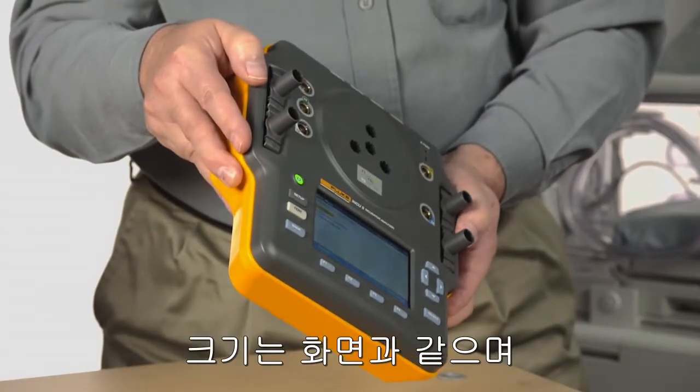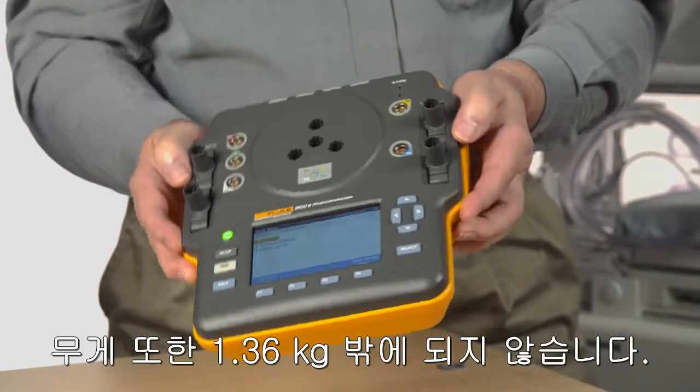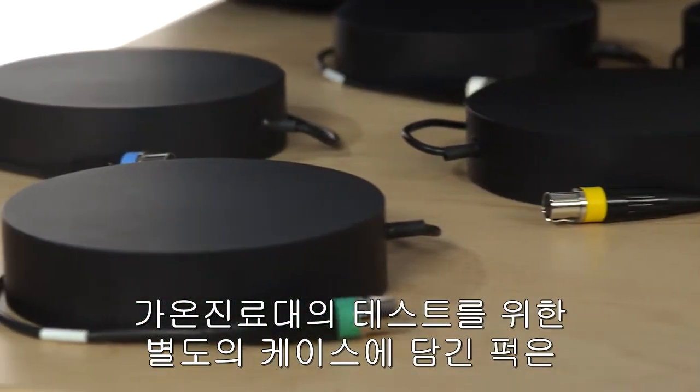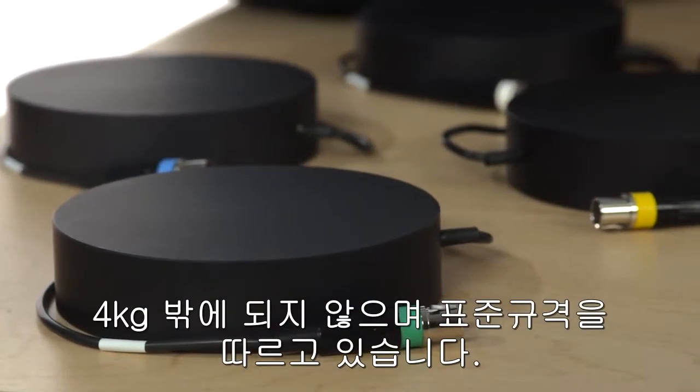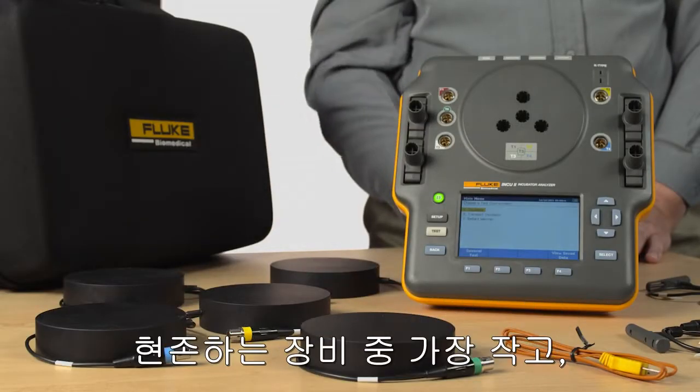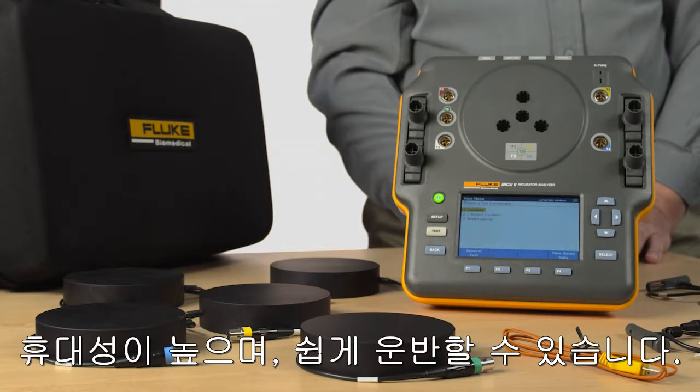You'll quickly notice its size — just 3 pounds, including the sensors for testing incubators. The pucks for testing radiant warmers come in their own case and weigh less than 9 pounds to comply with standards. Nevertheless, the INQ-2 is the most compact, portable, and easy-to-carry analyzer of its kind on the market today.